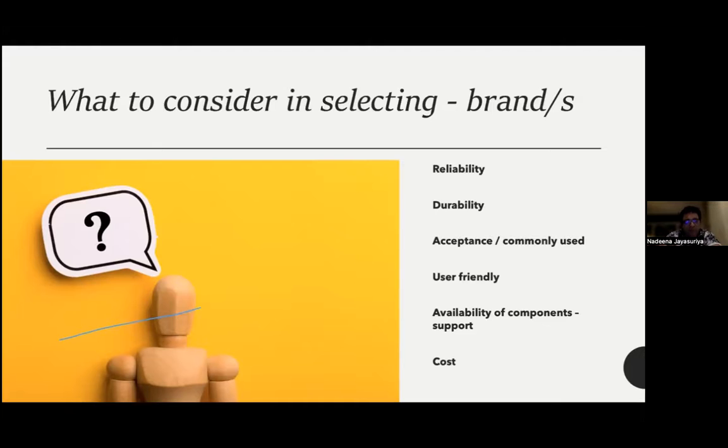But sometimes you find the most advanced type of dental implant sold in Sri Lanka, but when you ask for a part, they say that they need about 2-3 weeks to provide that. That means the company or the agent has not invested a lot in the implant. If you rely on such an implant, it might be difficult for you because the patients might want to go abroad immediately. So you can't take too long for the treatment.